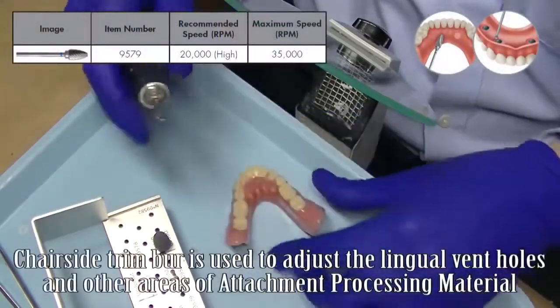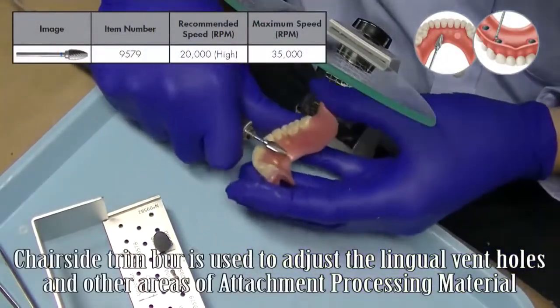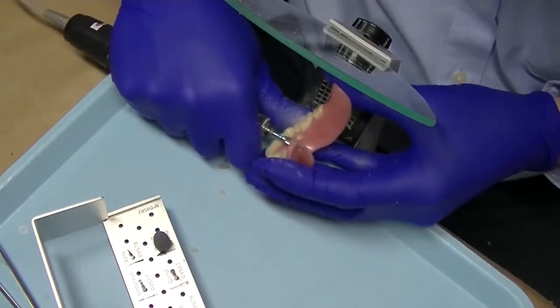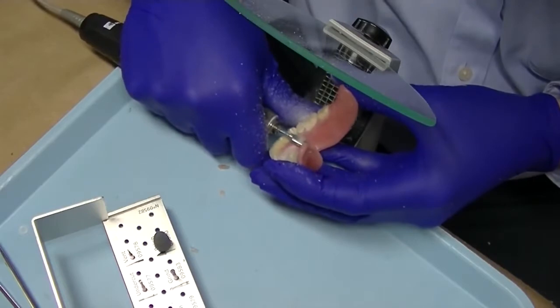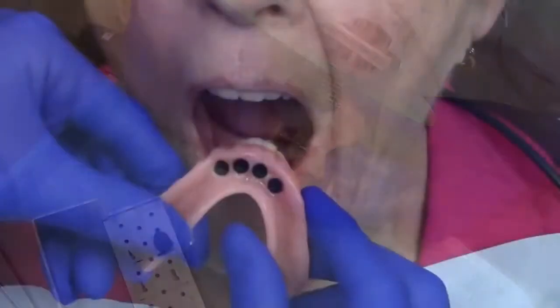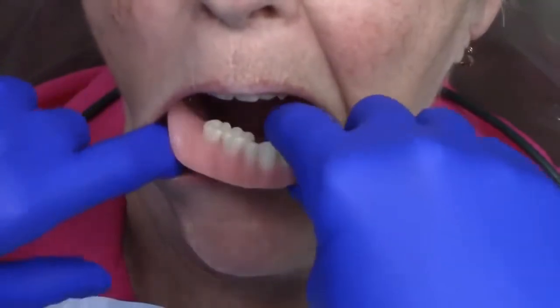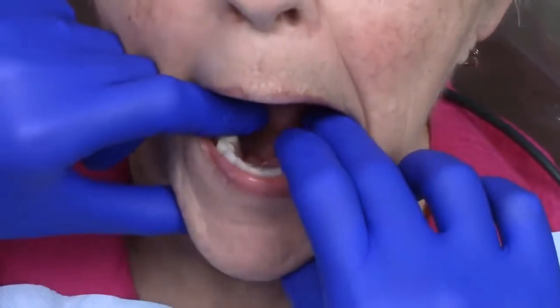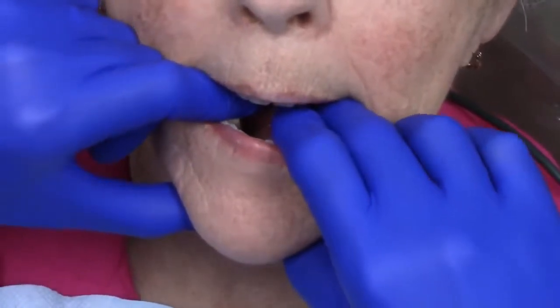The next step is to take the chairside trim burr. The trim burr is perfectly suited for trimming the lingual or palatal portion of the complete denture, and especially any areas of vent hole excess. After using the trim and grind burr and cleaning up the denture, I seat the denture back onto the edentulous ridge prior to doing any fine polishing adjustments.